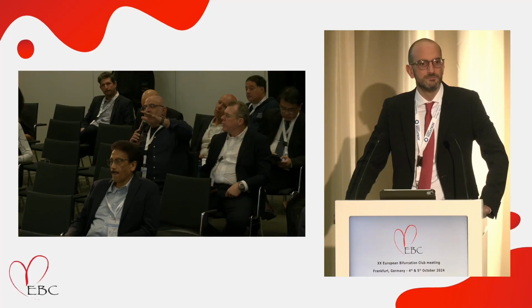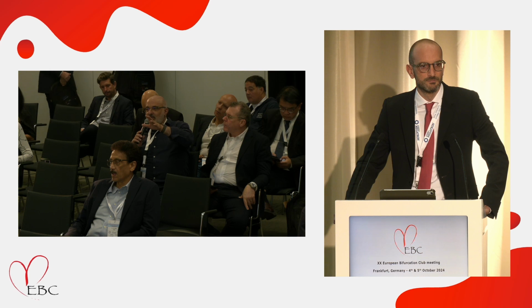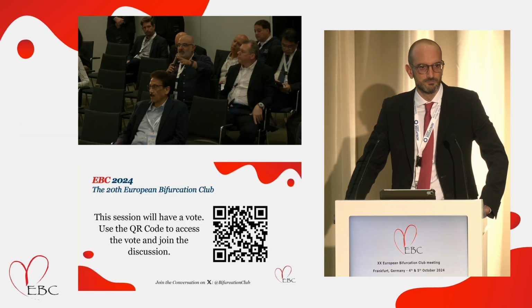A question from the floor. Yeah, it's more of a comment. You can't argue with success, and you had a good result, so congratulations on that. My only concern was, you were dealing with a CTO, and unless it didn't project well on the pictures, you didn't really know where you were going, because you didn't do a dual injection to see the retrograde filling.